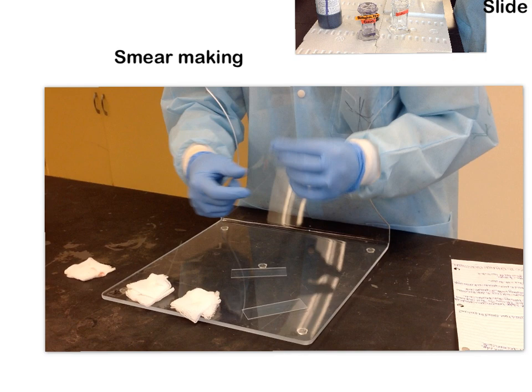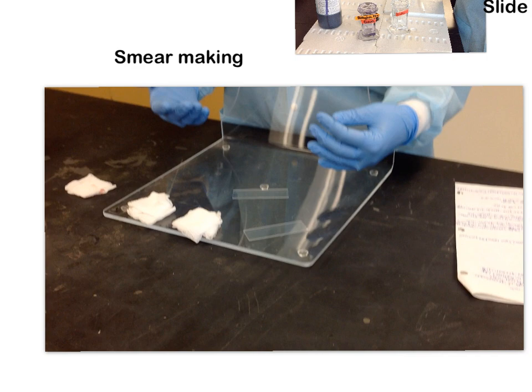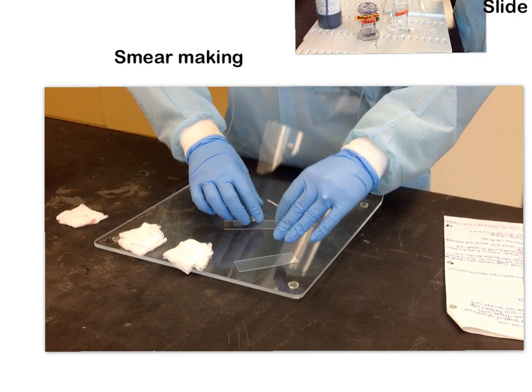The last variable is the size of the drop of blood you put onto the specimen slide. If you use a big drop, you'll have a really thick, goopy slide. If you use a tiny drop, you'll have a tiny slide. The ideal size is about a 1 to 2 millimeter drop, placed about an inch up from the edge of your slide.